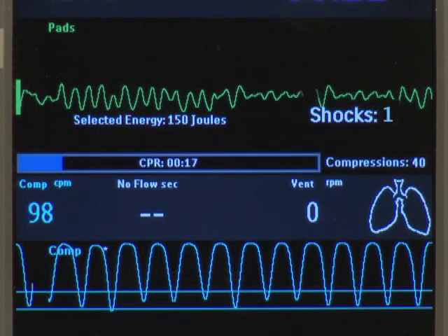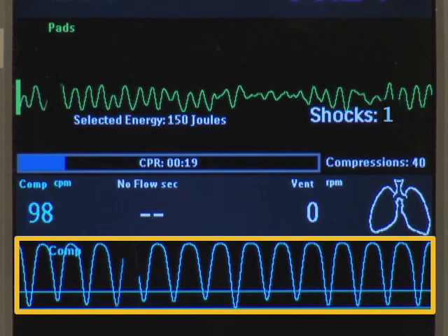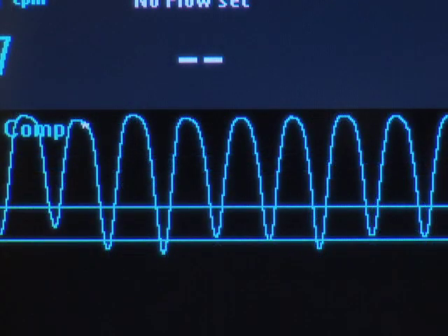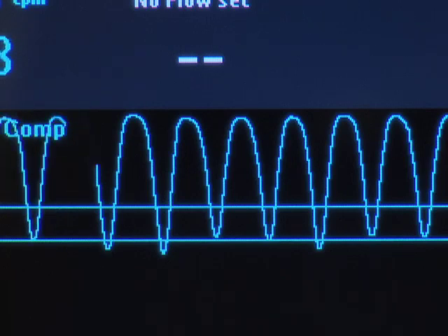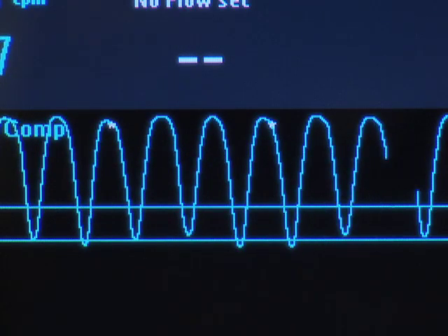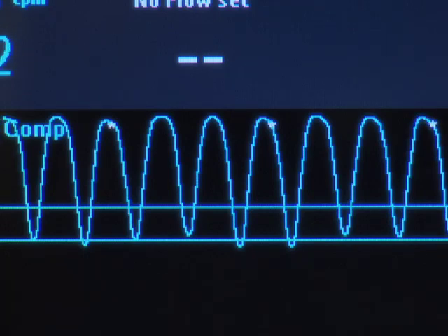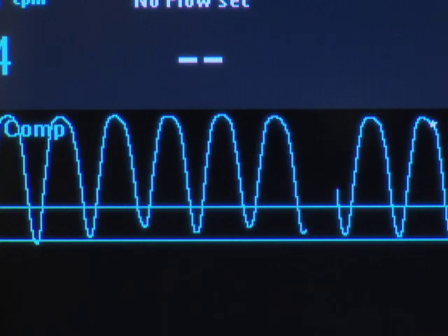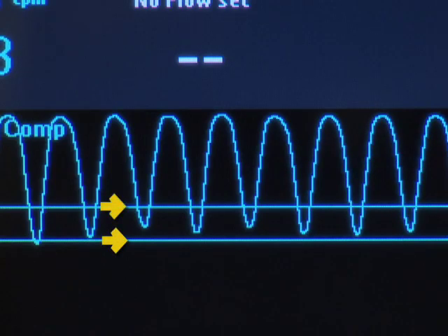In manual mode, the compression waveform appears here and is labeled COMP. As the chest is compressed, the wave's downward stroke occurs. As pressure is released, the wave rebounds up to a baseline. Keeping the bottom of the wave in this target zone achieves good compression depth.